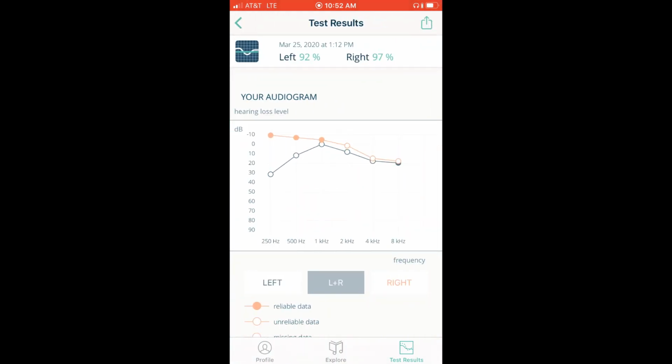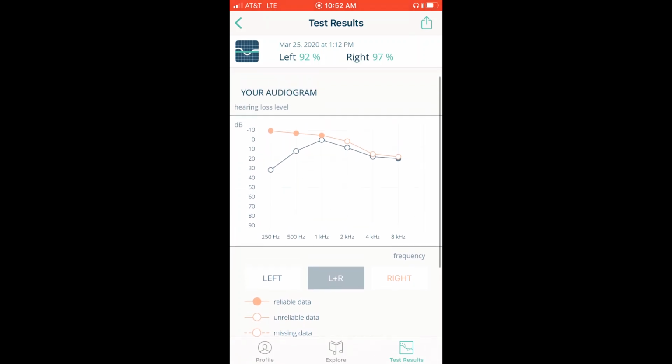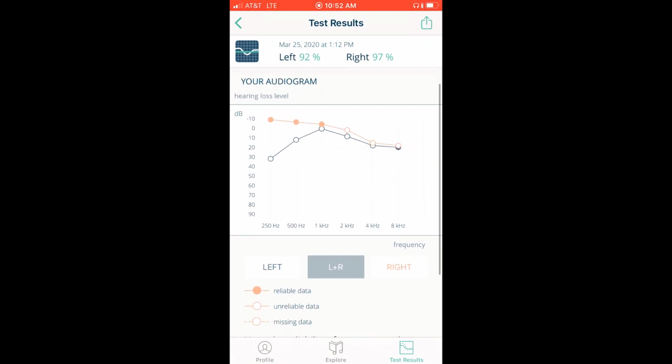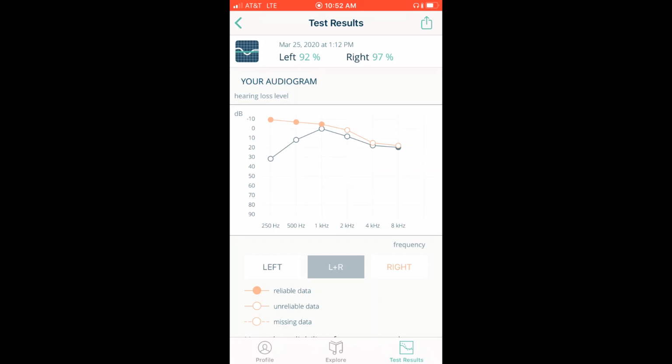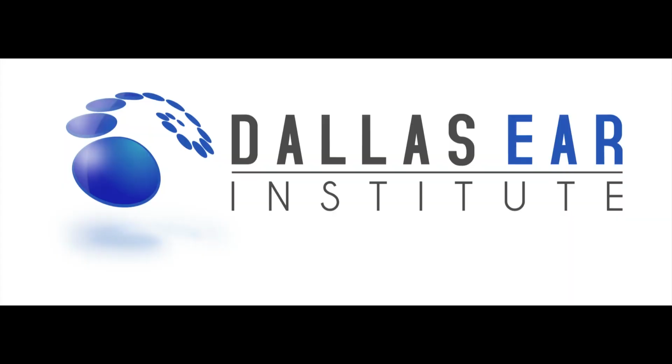This graph is what is important. This is called an audiogram. These are true to my hearing results in a booth, and so now I want to send them to myself. So in the top right corner, I click that little square with the arrow up, and it sent me an email with those results. So those results are what you'll send to your physician at Dallas Ear.